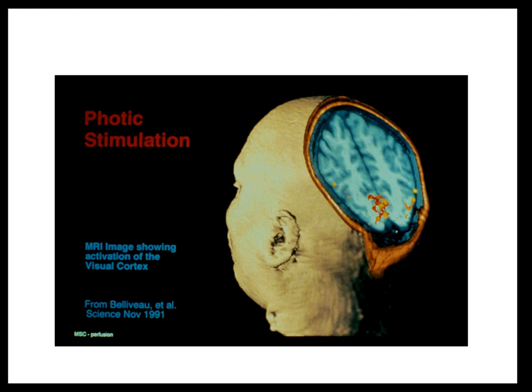And like I said, it made a huge splash. Jack Beliveau won the Young Investigator Award at ISMRM that year in 1991. And it made the cover of Science in November of 1991. But never after this issue of Science was it really used as a brain activation method because, of course, it was invasive. It involved contrast agents, two steps. It was kind of cumbersome.